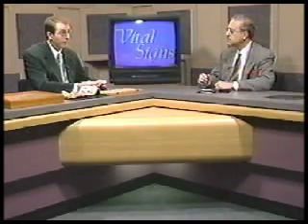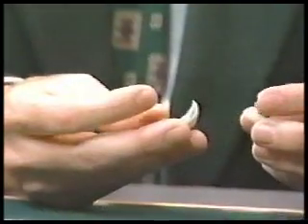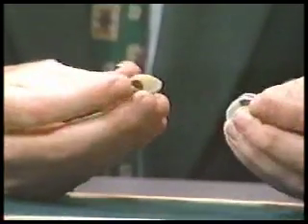Now, you mentioned that they're usually, or they used to be made out of glass, and we call them the glass eyes. Show us one of those pieces that you have there, the glass eye, and then we'll talk about that more. Okay. Yeah. The eyes used to be out of glass, and they were made in Germany. Hand blown. These pieces, these are two broken pieces.